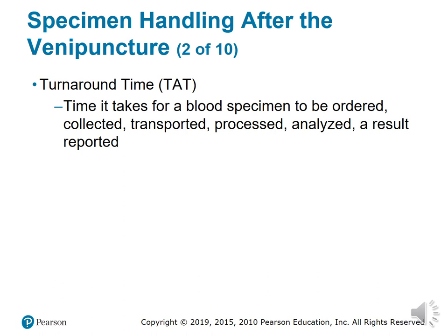Now, I talked about earlier TAT, or turnaround time. Turnaround time plays a significant role in the fact that blood can only stay within a tube or outside its source without being spun within a certain time frame before the cells start to break down. Then when we go to centrifuge it and the med techs go to run the laboratory test required from that specific tube, it might come out with an erroneous result. So turnaround time is very important, especially if we're working outpatient.